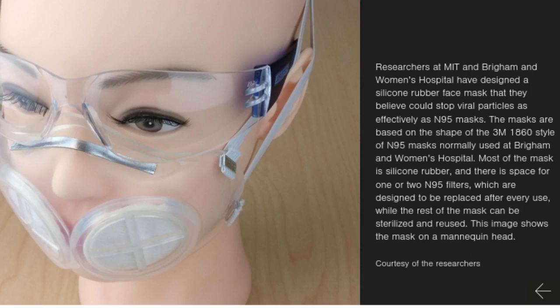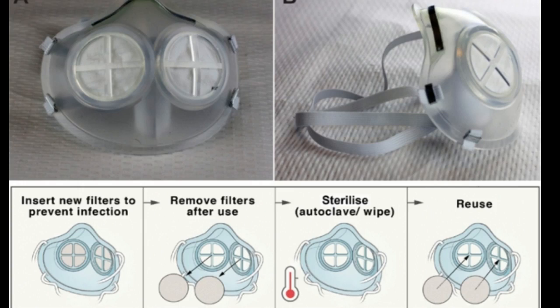As the number of new COVID-19 cases in the United States continues to rise, there is still an urgent need for N95 masks for healthcare workers and others. The new mask is made of durable silicone rubber and can be manufactured using injection molding, which is widely used in factories around the world. The mask also includes an N95 filter, but it requires much less N95 material than a traditional N95 mask.